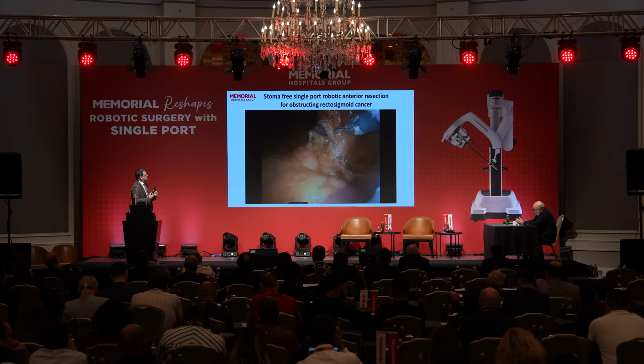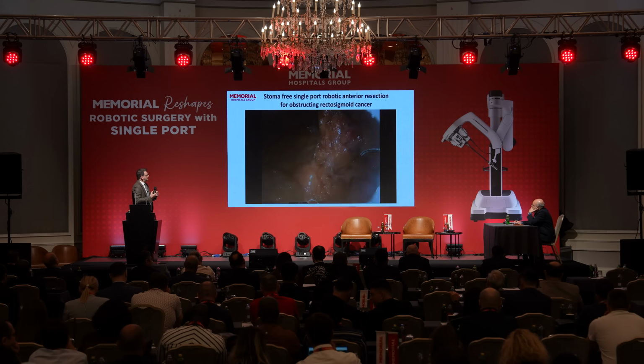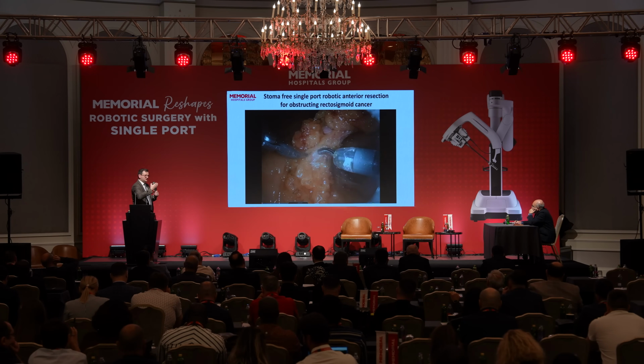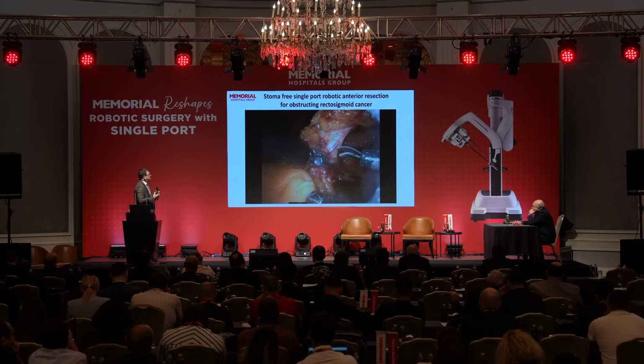In addition to its maneuverability, their structure gives you a visual haptic sensation. We don't have this in multiport surgery. So with this, you can go more precisely to the delicate regions.